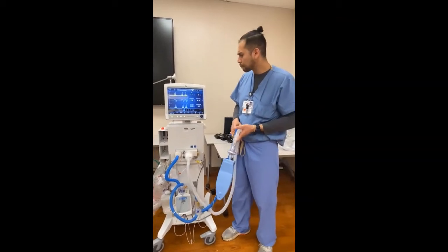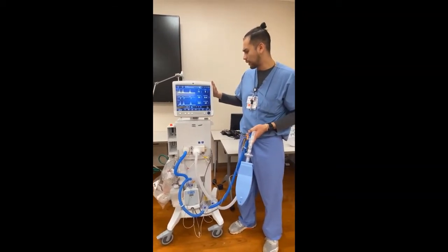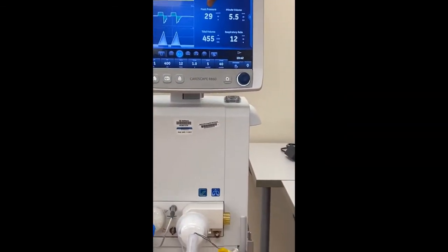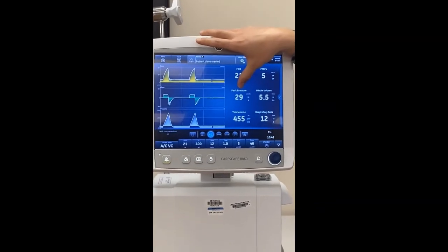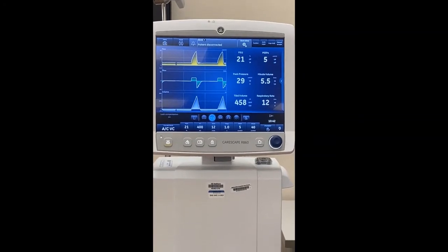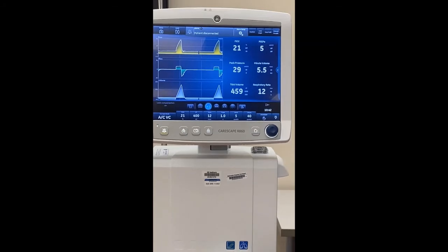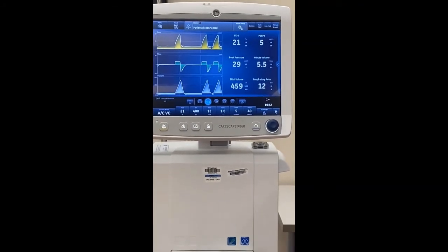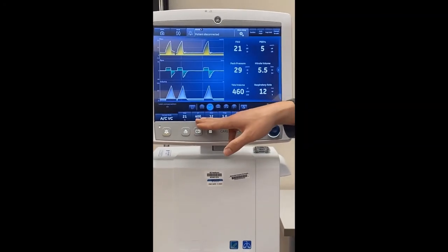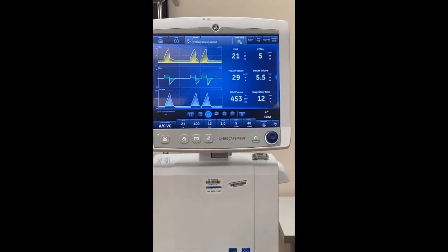If the patient has a chronic trach, they may be the exception to that. But I would say the three most common values to look for when it comes to the ventilator start with how the patient's doing peak pressure wise. We don't want to go over 40. Anything over 40 can cause some barotrauma and can potentially cause a pneumothorax or tension pneumothorax. We also have our tidal volumes. We definitely want to be sure that the patient is getting adequate volumes. Whatever is set, the ventilator should be delivering a minimum of that and a little bit over if the patient's giving some effort.